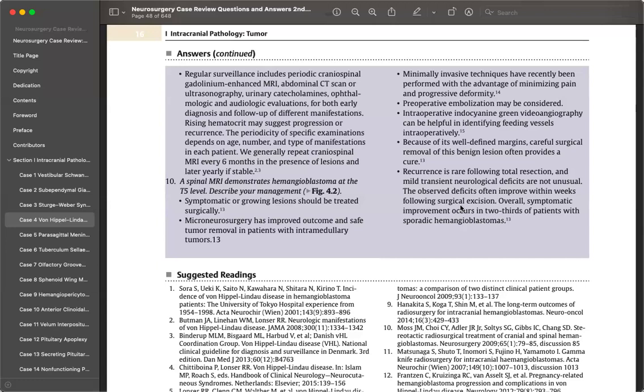They talk about a treatment plan using a median dose of 22 gray, a range of 12 to 40 gray, prescribed to the median isodose in 1 to 4 sessions. So you can give it up to 4 sessions. The treatment should be concentrated on the mural nodule. You can ignore the cyst and just focus on the nodule.